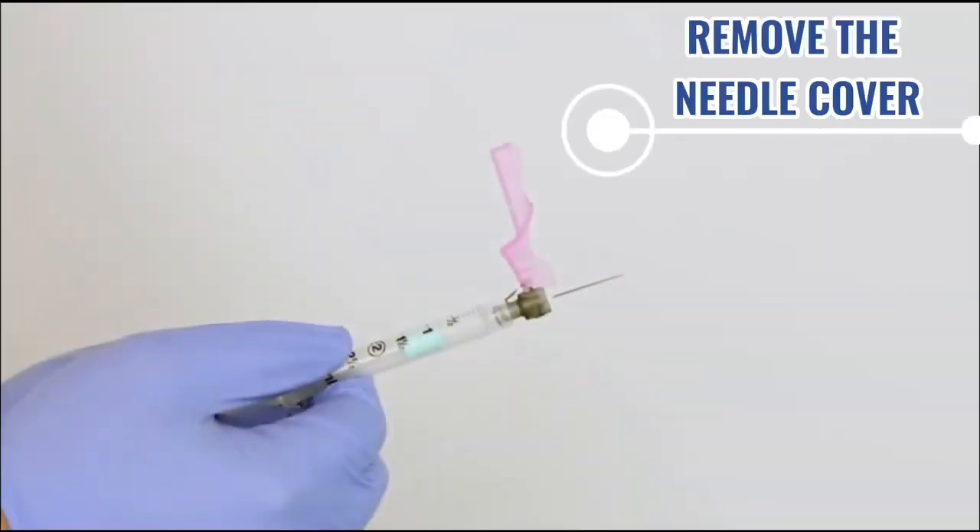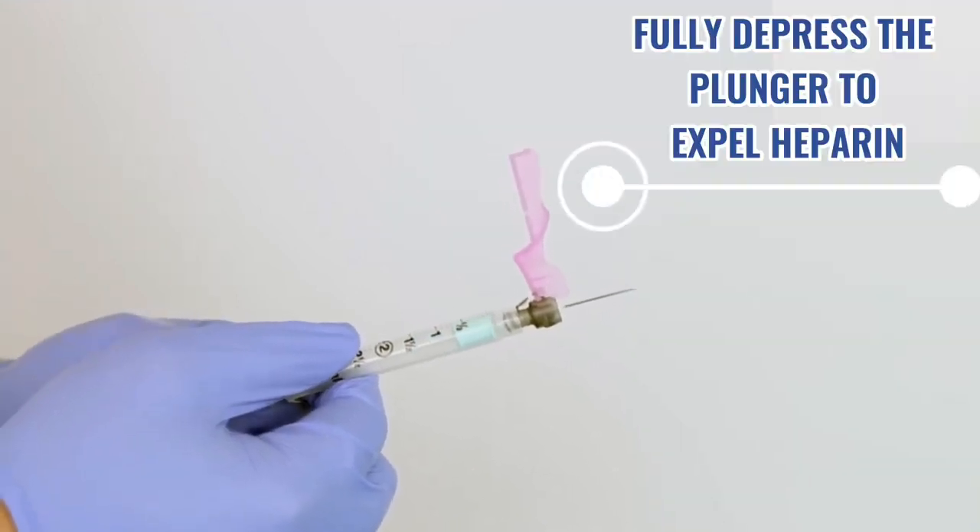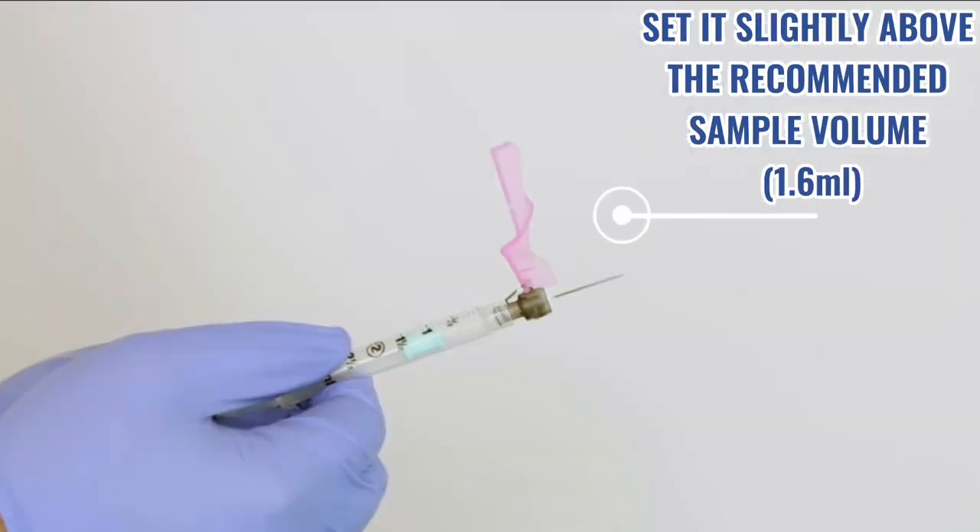Remove the needle cover. Fully depress the plunger to expel heparin. Then, set it slightly above the recommended sample volume of 1.6 ml.